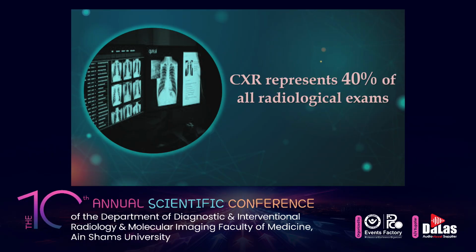Chest X-ray represents 40% of all radiological exams. If AI can help with a certain study, it will be always chest X-ray to reduce the workload for the radiologists.